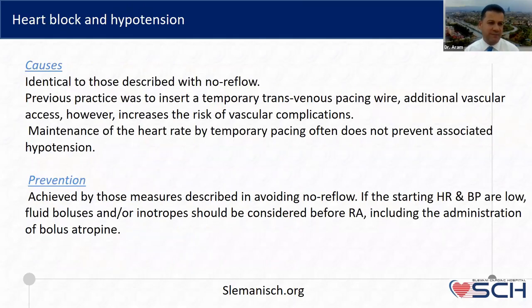Another complication is heart block and hypotension. I think that it is the same as no-reflow and slow flow.